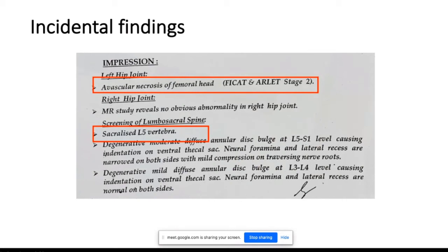If a patient comes to you with previously done MRI reports, even for low backache, don't ignore the patient, but examine once again along with these MRI reports. Most of the time, the MRI report and clinical findings should match. If they are not matching, there is some problem, I mean, there is an issue related to the diagnosis. We might have missed another structure or a neighboring structure which is causing trouble to the patient.